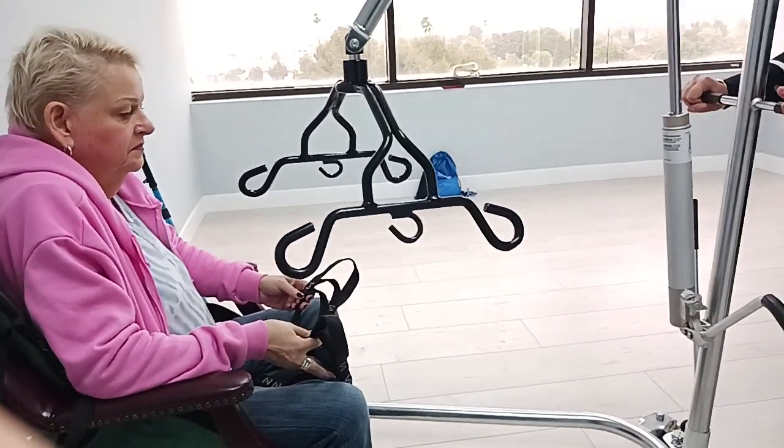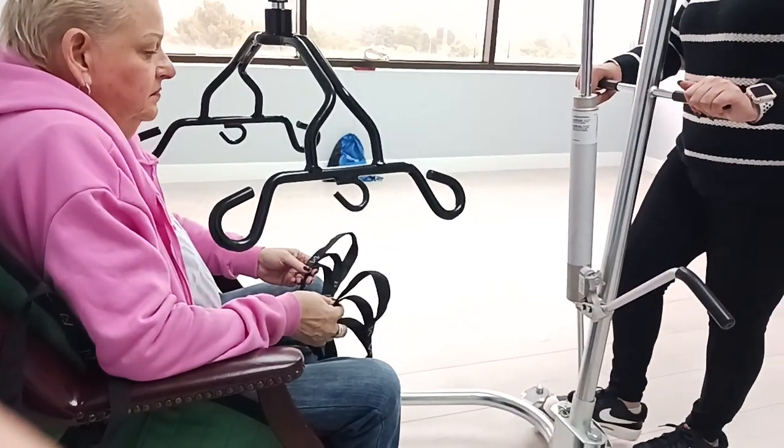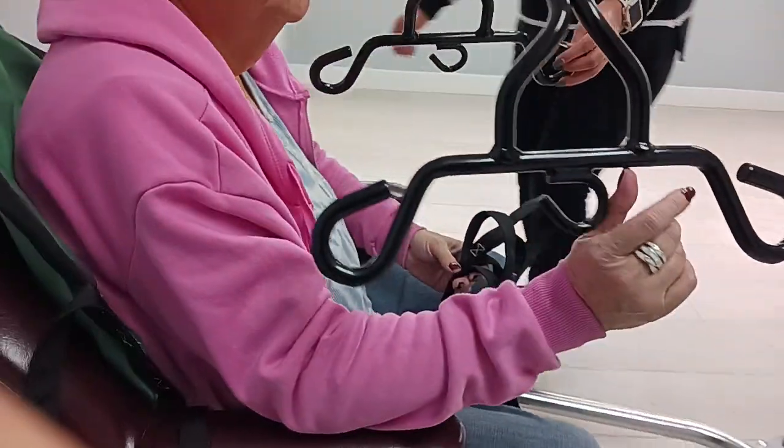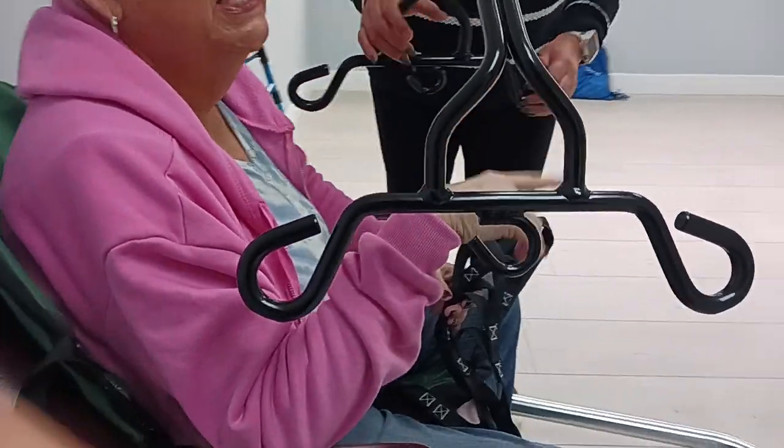And then we're moving it as close as possible without hitting the patient. And then we're locking it so that we can connect. It's super important to be mindful of this thing because it swings, it wiggles, it raises, it lowers — and if it hits you in the head, it hurts.